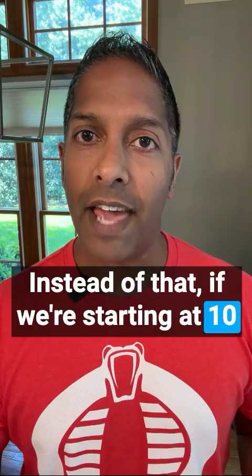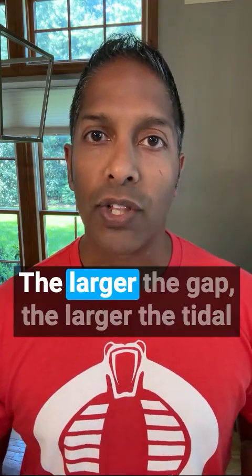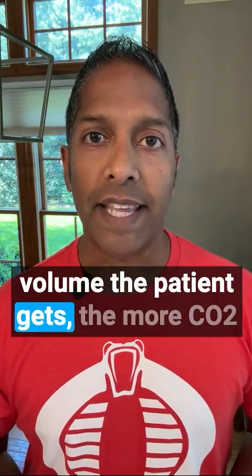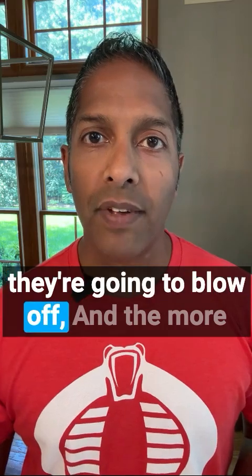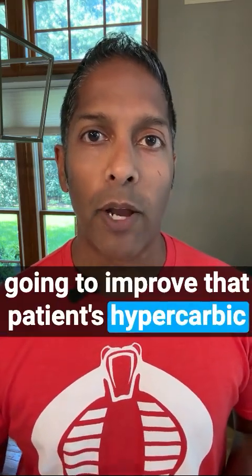Instead of that, if we're starting at 10/5, we want to go to 15/5 and then to 20/5. The larger the gap, the larger the tidal volume the patient gets, the more CO2 they're going to blow off, and the more likely that our non-invasive strategy is going to improve that patient's hypercarbic respiratory failure.